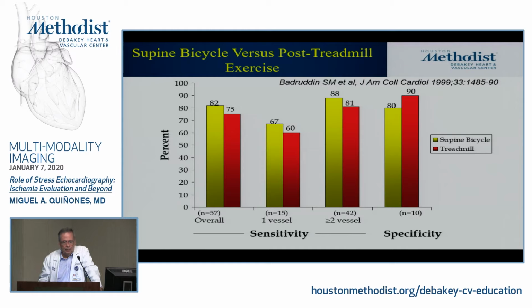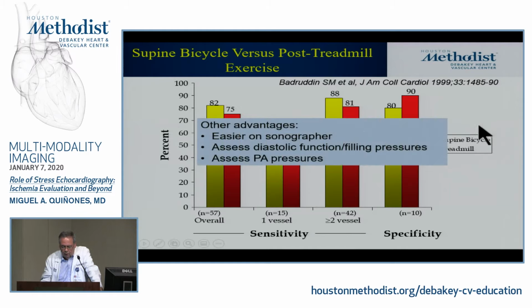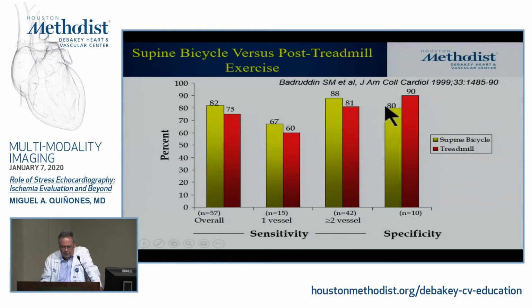So what we learned very early when this study was done, with patients who all had the treadmill and the bike, so you had to do 2 stresses in everybody and then a cath. Everyone got cath, in the days that we could do this. Now it's more difficult. And what we found is that they were very similar in accuracy. The accuracies were very similar between the two.